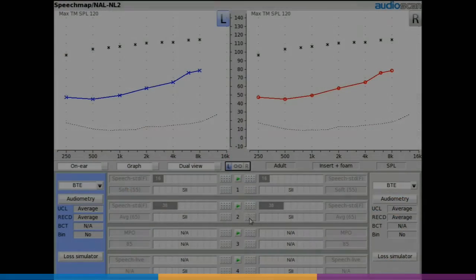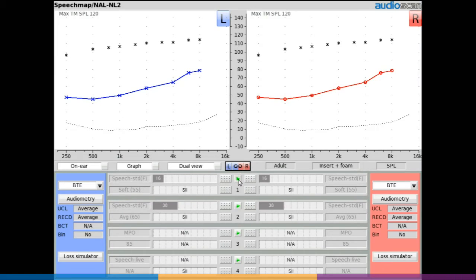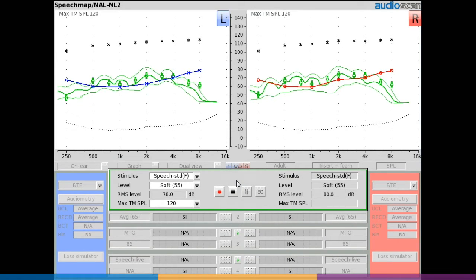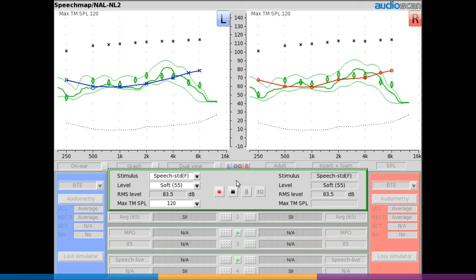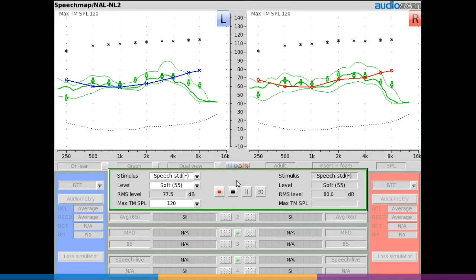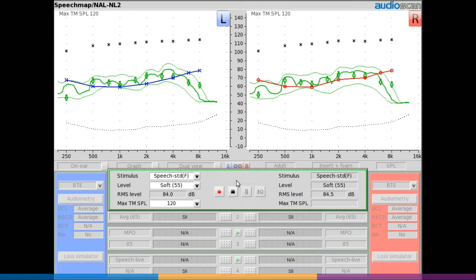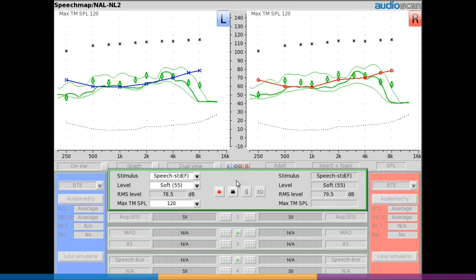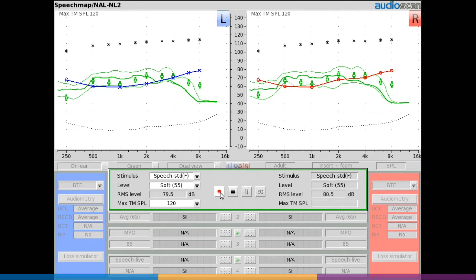Click the left-right link button in the center of the screen. When a test is initiated, the stimulus will be presented to and measured at both hearing instruments simultaneously. For the loop section, any difference will be averaged when ready to complete the measurement.